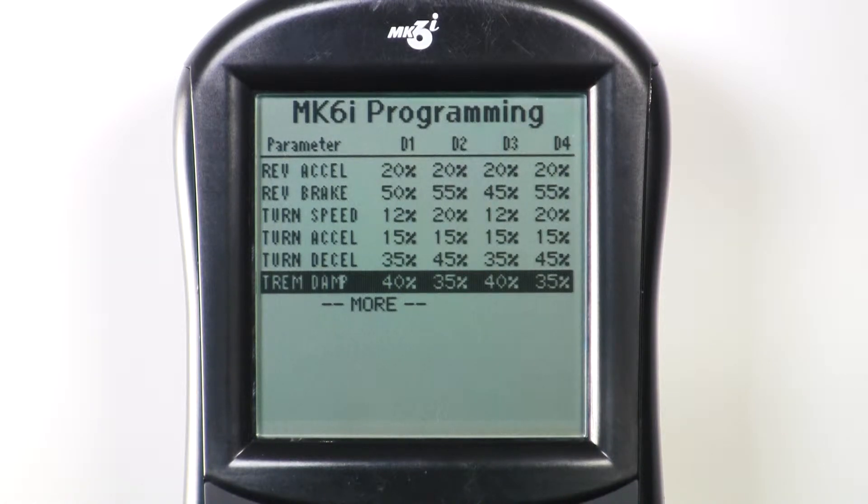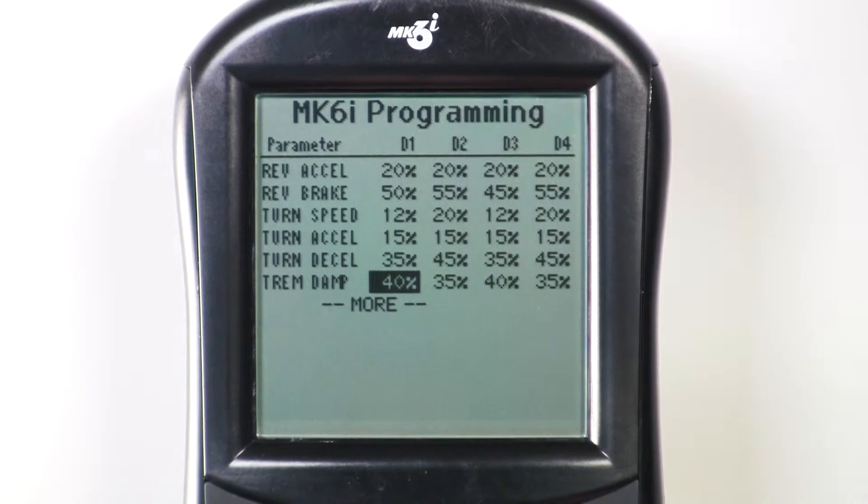The Tremor Dampening values you can choose range between 0 and 100. Assigning values closer to the highest value of 100 creates a softer or delayed response to joystick commands. If you're using Invacare standard programs like Moderate Outdoor or Indoor Learner, the pre-assigned values for Tremor Dampening are between 35 and 40.